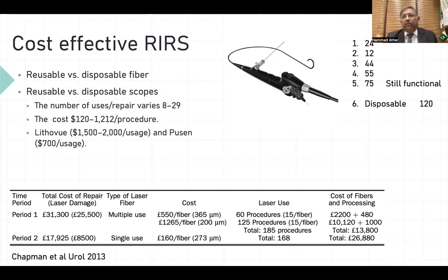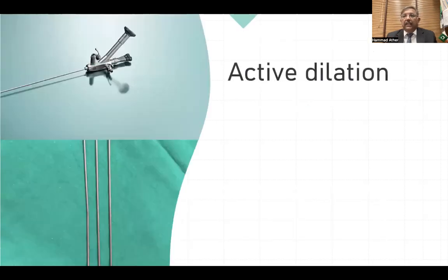But mind you, we use disposable scopes 3 times. It has to go through infectious disease evaluation, and they recommend that it can be used 3 times if properly sterilized. So that's how we were able to cut the cost down.